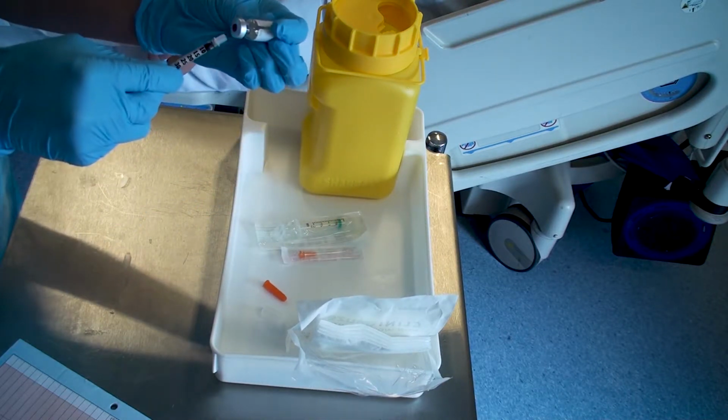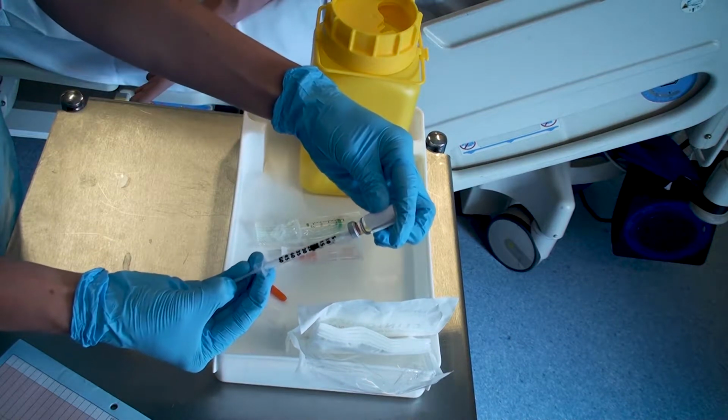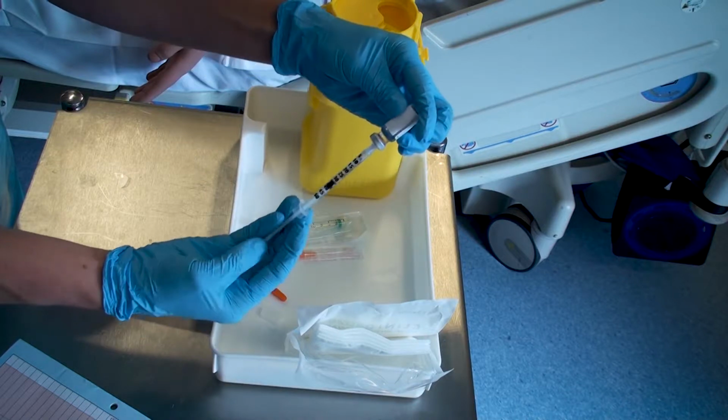In this case, we're using an insulin syringe, but you can also see we have an orange needle and a syringe if you were wishing to draw it up, not using this device.